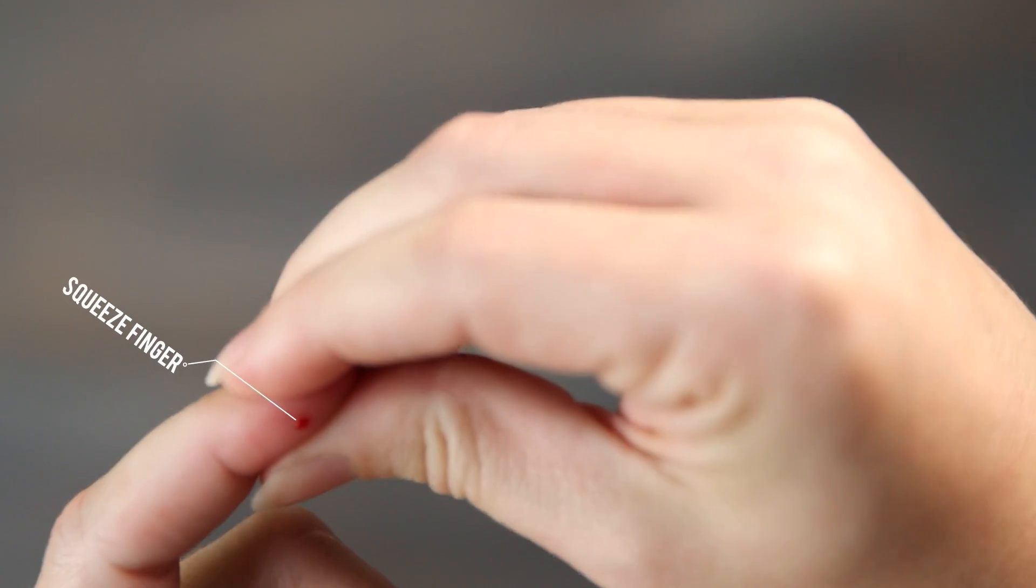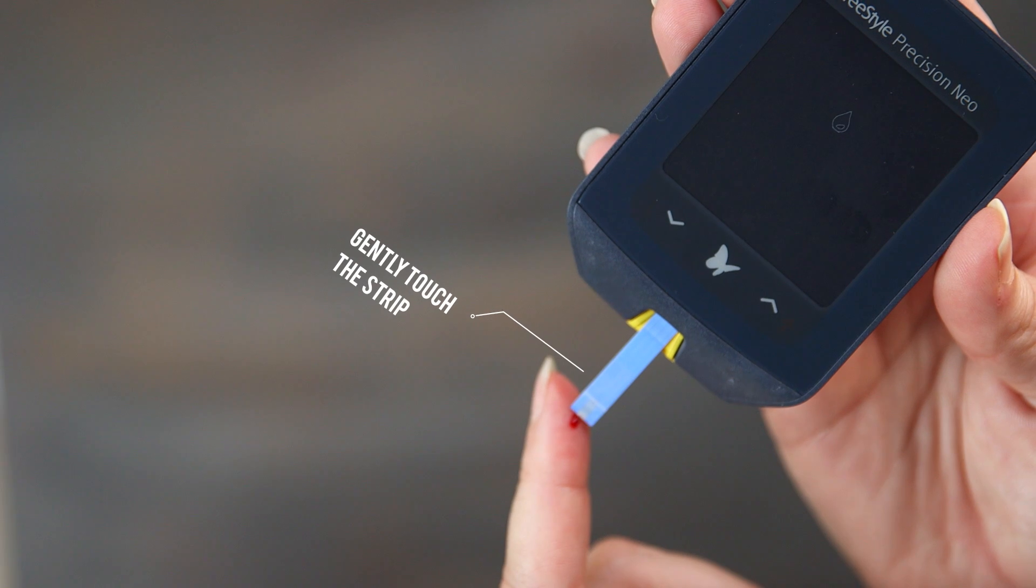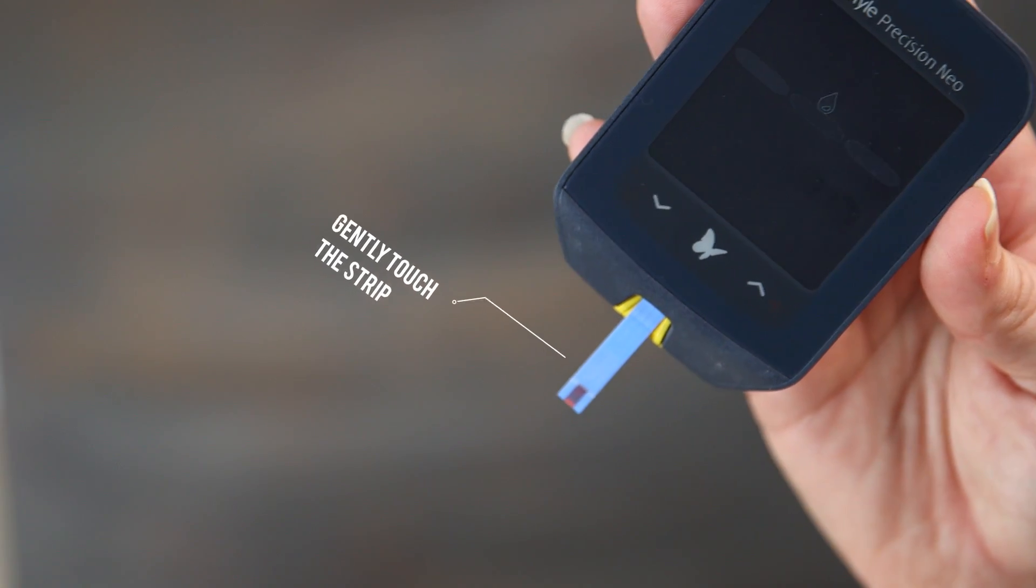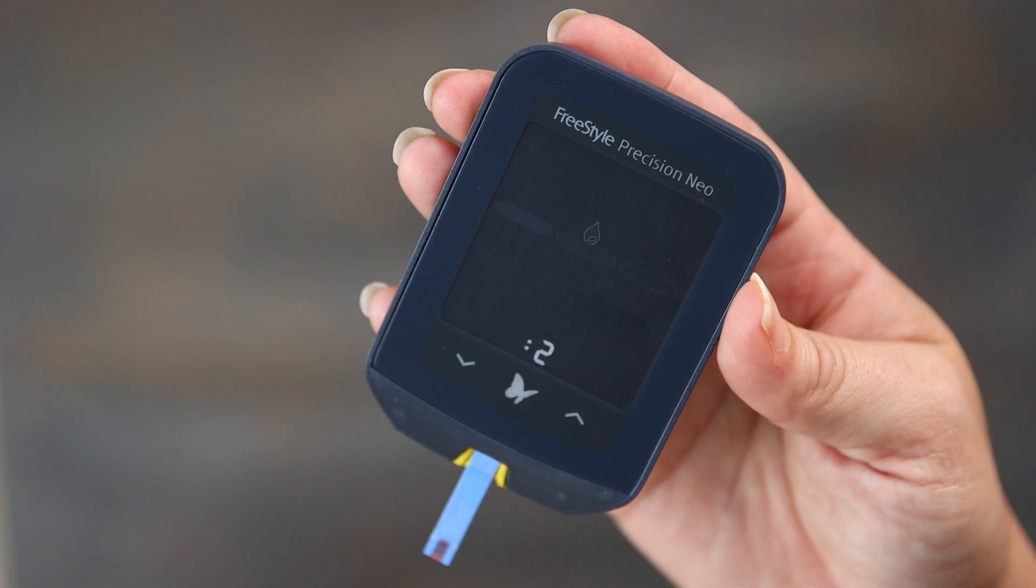Squeeze your finger just a little to get a drop of blood. Gently touch the strip. It'll pick up the blood and let the meter show your blood sugar reading.